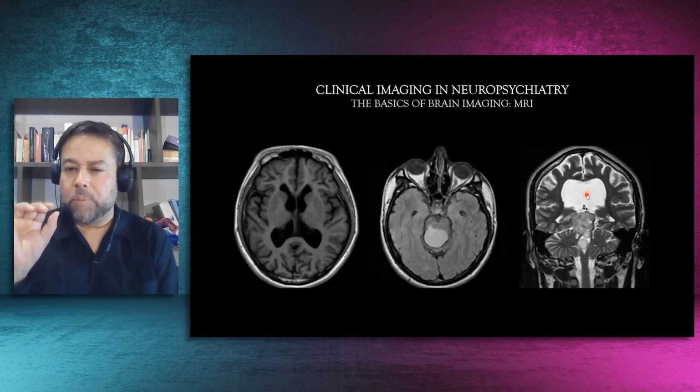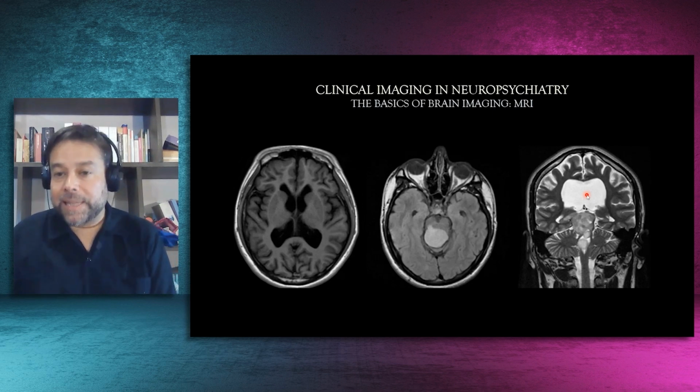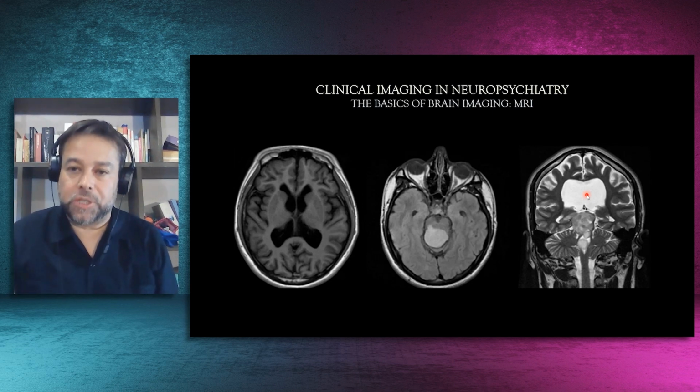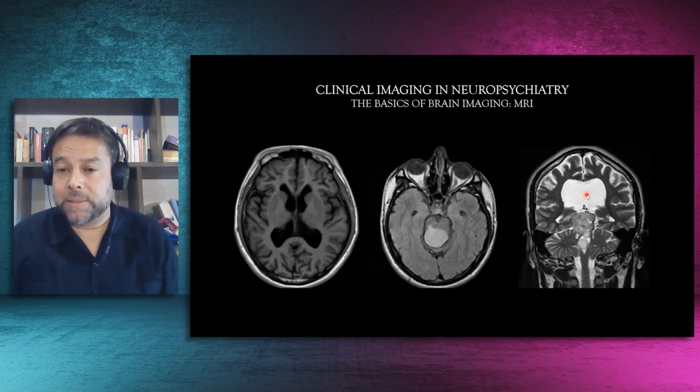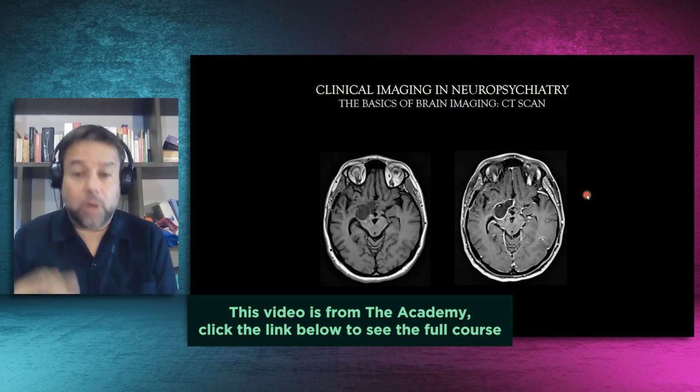So if you see a brain lesion with that signal, a bright signal, a hyperintense signal, you can make the inference that likely it has water inside the lesion. And that may be the case in old lesions, or it may be the case in degenerative disease leading to atrophy. Another principle is that we can use contrast.